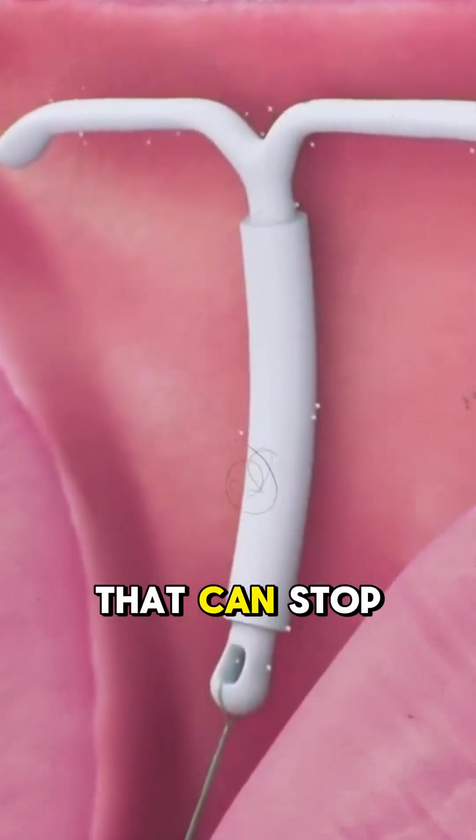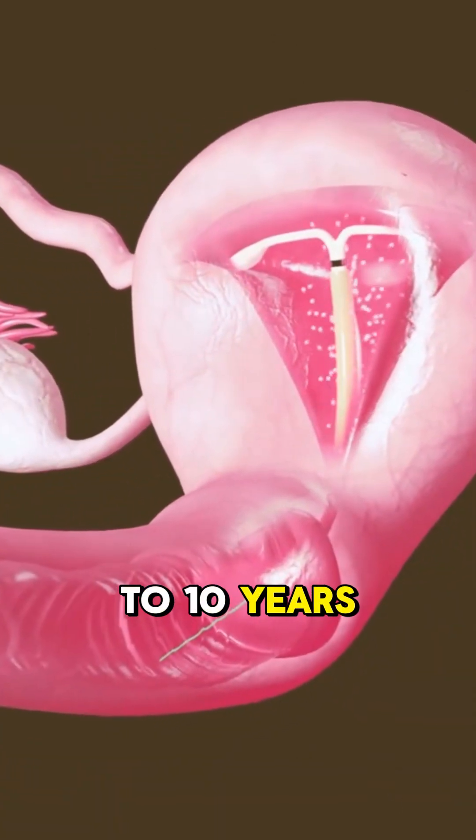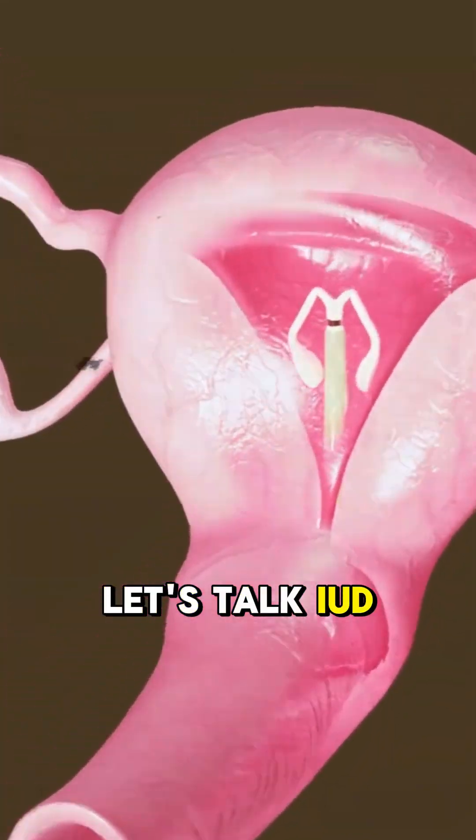A tiny T-shaped device that can stop pregnancy for up to 10 years? And it fits inside your uterus. Let's talk IUDs.